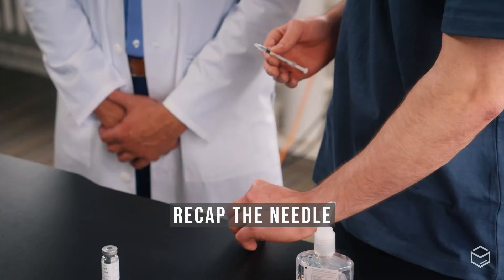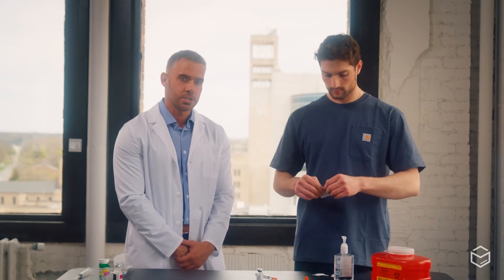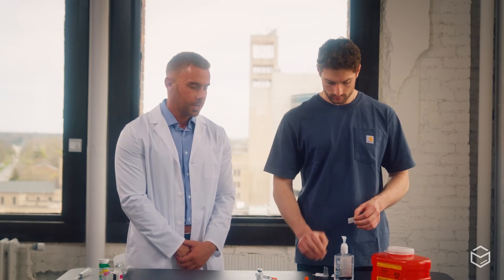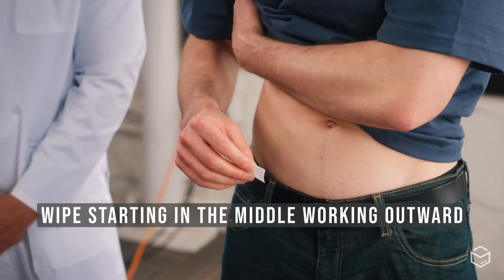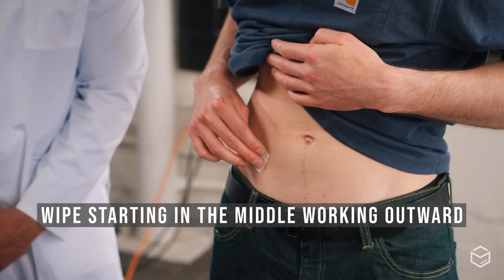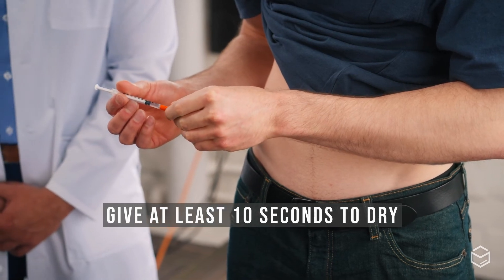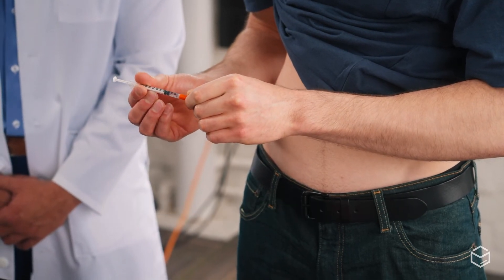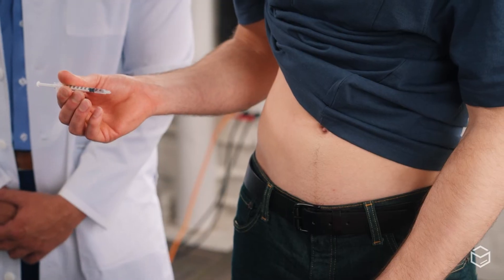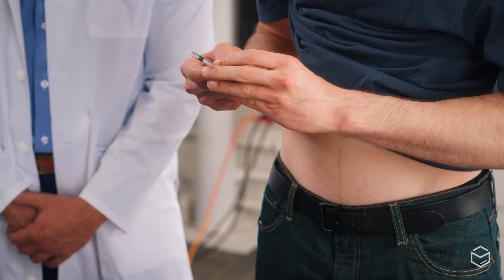After drawing up the desired amount of medication, recap the needle and set the medication aside. Now prep the site for injection using an alcohol swab. For subcutaneous injection, we prefer the lower abdomen where there is subcutaneous fat. Wipe with the alcohol starting in the middle and working outward. After it's dried for about 10 seconds — without blowing on it — take off the cap and ensure there's no air in the syringe by flicking it and pressing out a small bit of fluid from the tip of the needle.